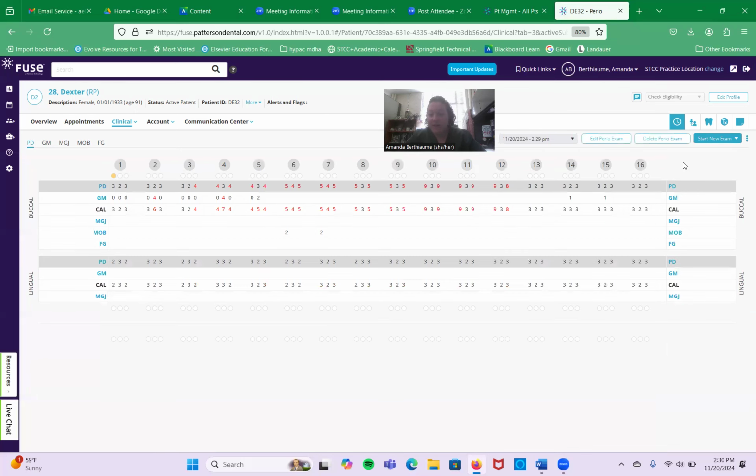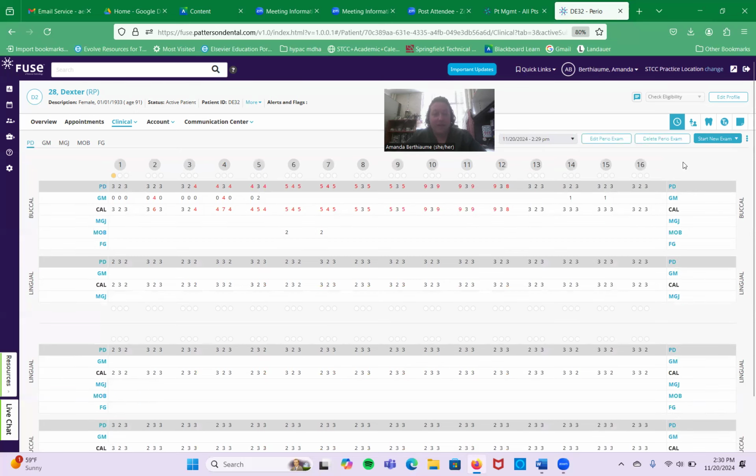Perio charting is done about once a year on healthy individuals and once a year for everybody. If they have had a history of periodontal disease, they might be perio charting at every appointment, so every 3 or 6 month appointment. So that is kind of the nuts and bolts of the perio chart.